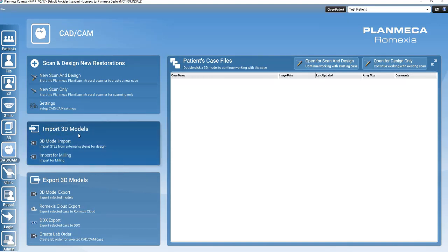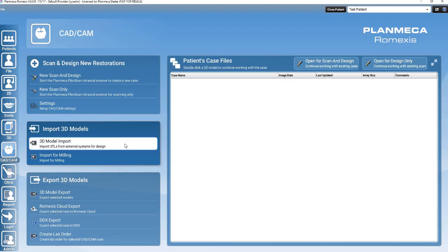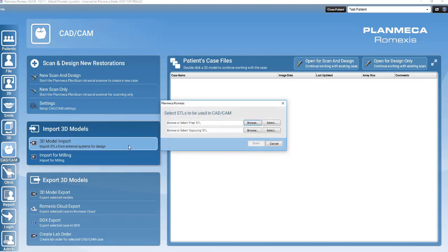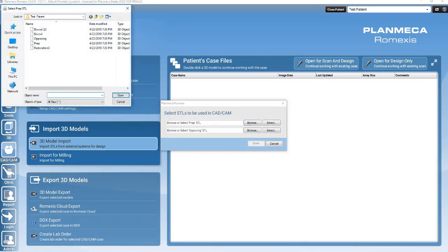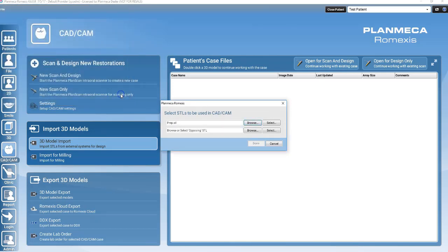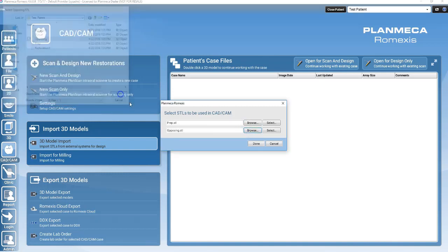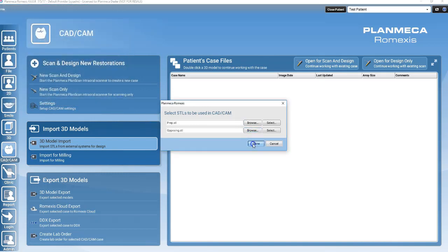Click on the first option. A dialog box will open. Note only the prep and opposing STL data can be imported. Click Browse next to the Prep STL box and navigate to the file folder where the STL file is located. Repeat the same step for the opposing STL file. Click Done when you are finished.